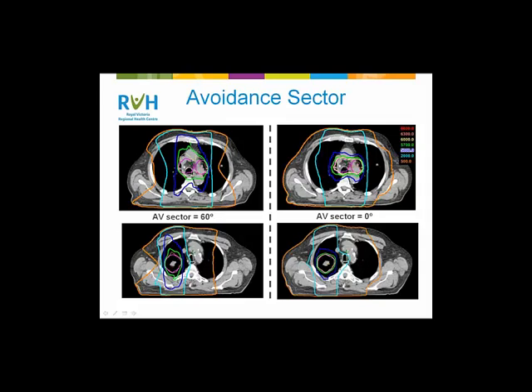And really the only thing is if your isocenter is not placed very well, then your fields in the RapidArc get bigger, and if they get too big, then the MLC can't reach where it needs to when it's optimizing, and you can end up with poor conformality and a little bit higher dose to critical structures. So usually what we have the planners do when they're finished a plan, and I think this is a great practice for all RapidArc, is turn on the beam's eye view, play the movie of the MLC motion with your target, your PTV, on as a structure, and take a look as you rotate around the patient. If you see MLCs that hit their limit at any point and it looks like they should be closing but they're all lined up in a straight line, that means your field size is too big. The MLC wants to go there but it can't because it's restricted. So in that case, it's good to do some technique to try to reduce your field size, maybe using a dual arc or something like that.